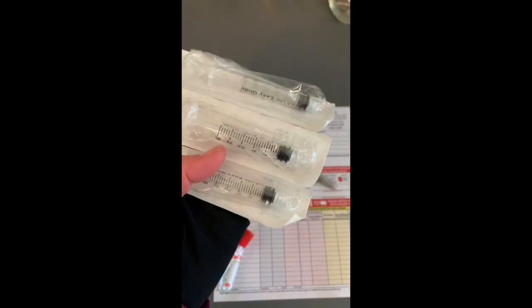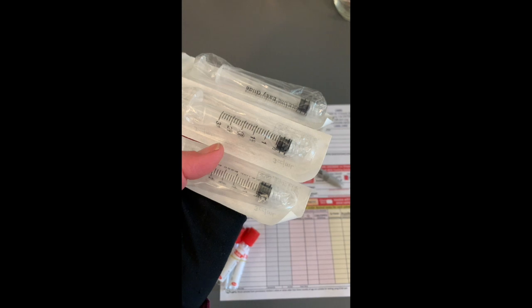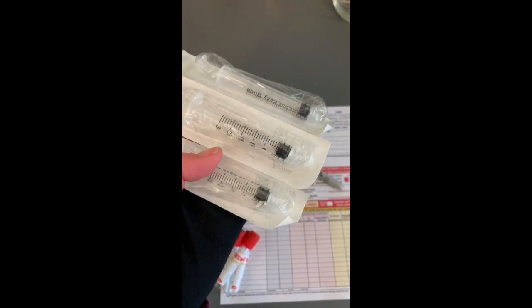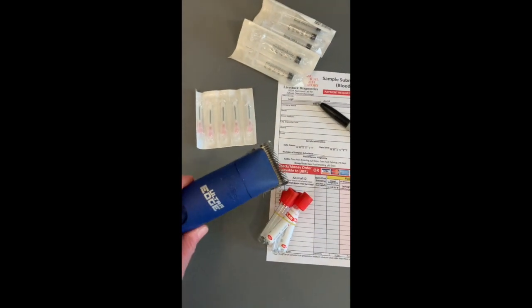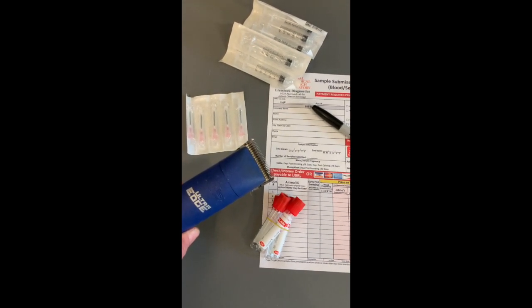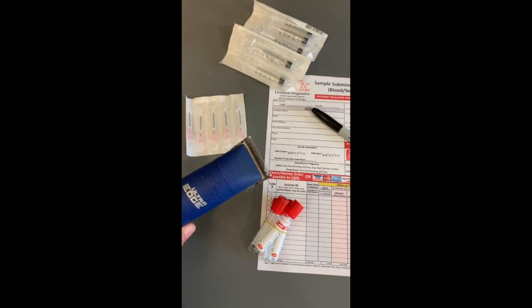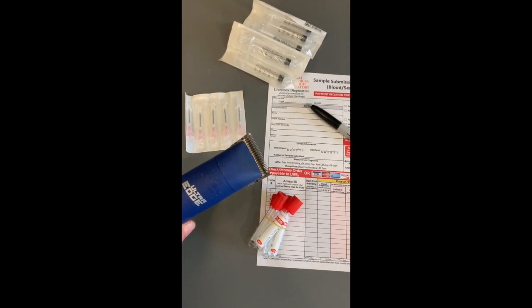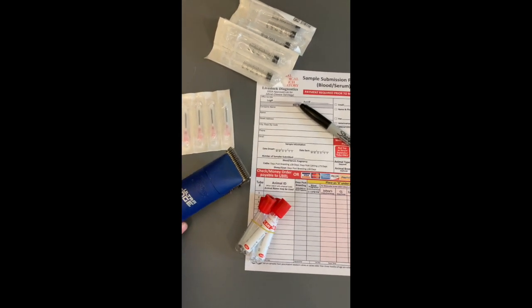Three cc syringes. Most samples require at least two to three cc's, and some labs even require five cc's of blood, so these will work for what we are testing for today. You're going to want hair trimmers for trimming the hair from the neck. In the summertime if your goat has a really short coat you might not need this, but in the winter it's going to be really hard to get that needle in just the right spot if you can't see what you're doing, so we recommend having a pair of hair clippers.